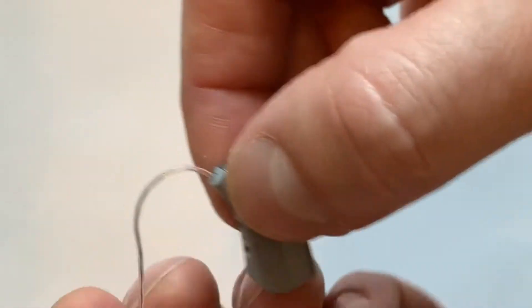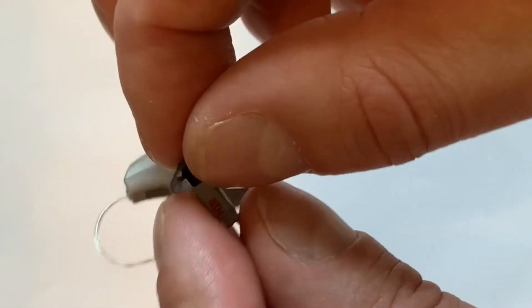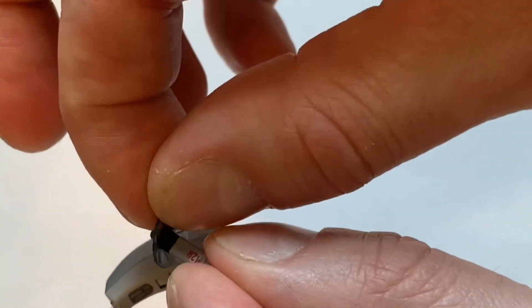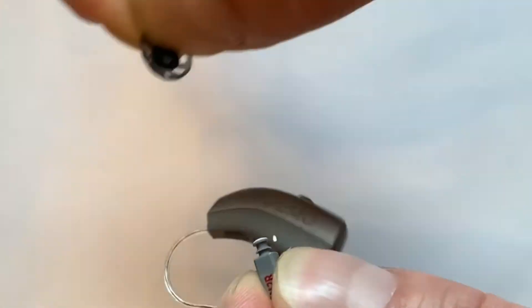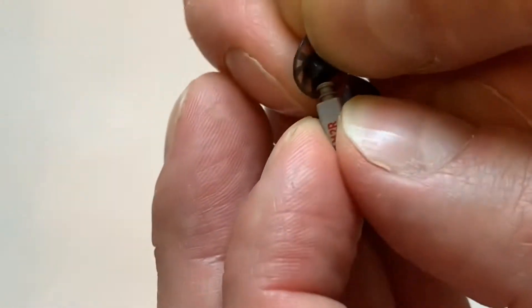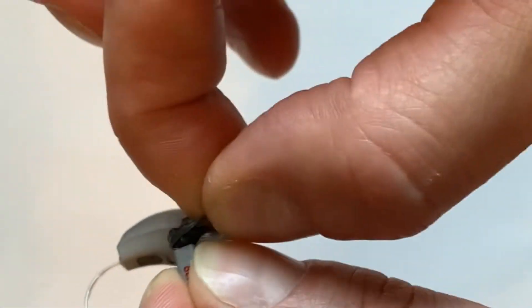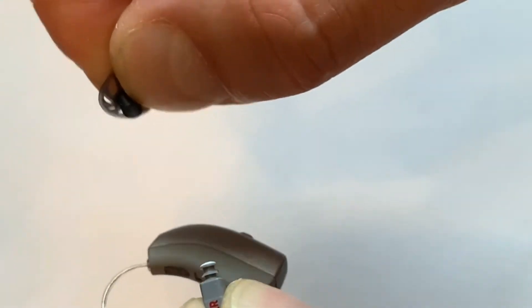So sitting on the end, the piece that goes into the ear is the dome. We're going to remove that simply by grabbing a hold of the flange and pulling straight off. It's important that you don't grab it and try to pull laterally sideways. You want to take it right off the end.